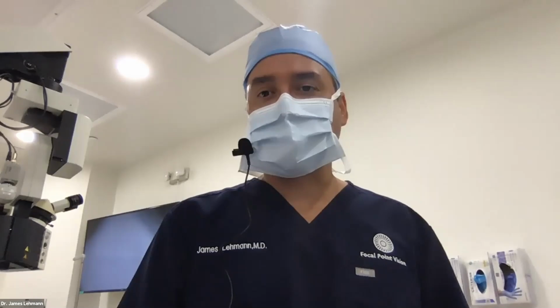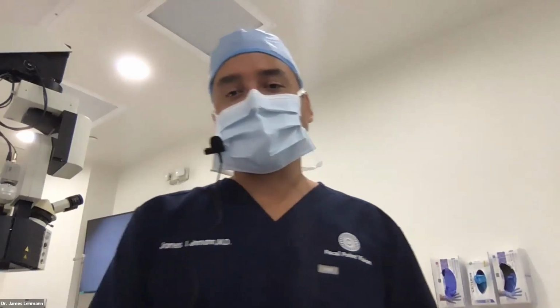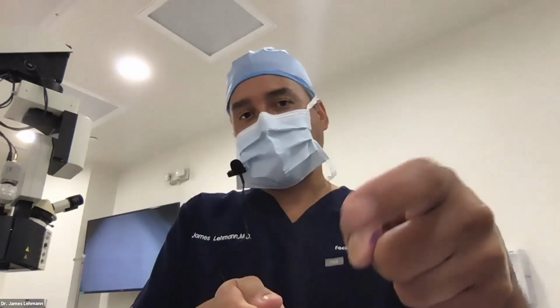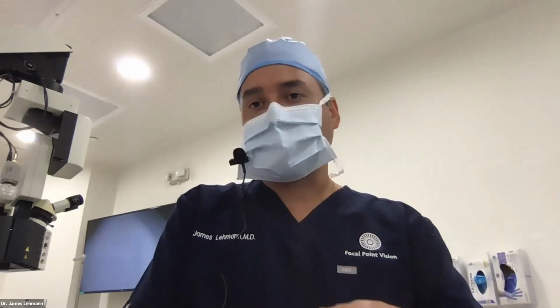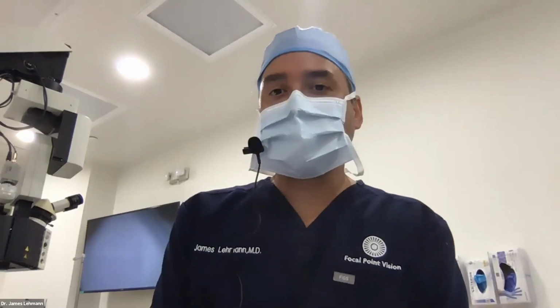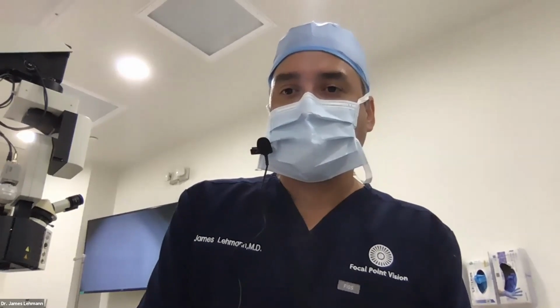Dr. Shrestha asked, how do you do a direct chop technique? You have to have different parameters, and you go in and you pale the nucleus and then put a chopper behind the equator and then bring it to your phaco tip. So that's a big technique. Like that could be a whole lecture in itself, so I'll pass on that. What phaco parameters? Like Dr. Cherwick said, I would go to the Orbis website and look over some of those phaco lessons there.